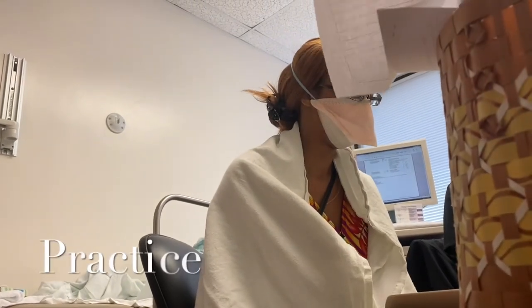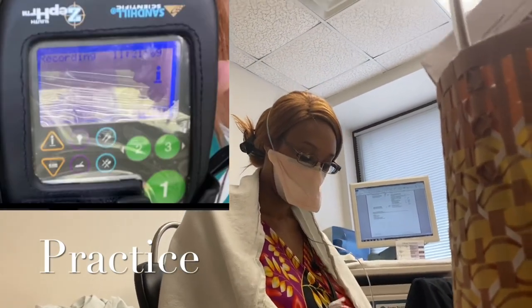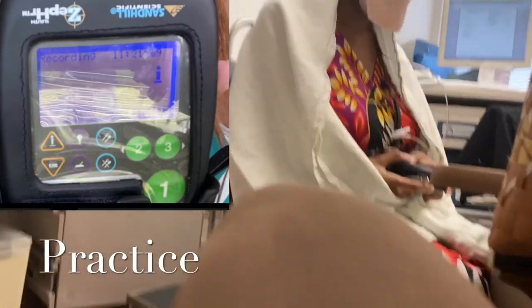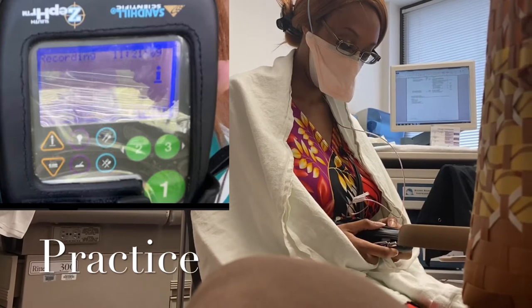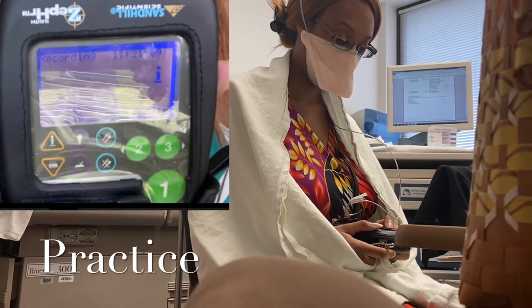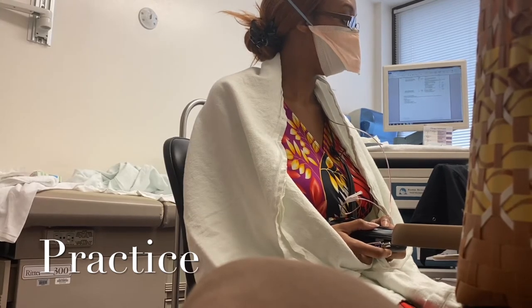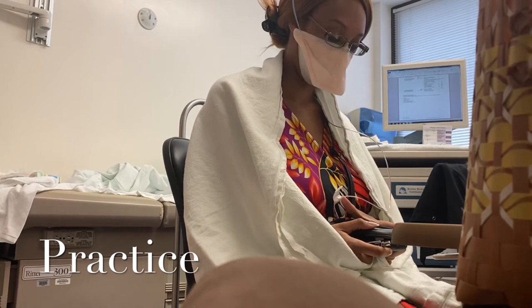Let's bring your monitor around so you can see it. It goes dark to save the charge from the battery. Push the light bulb. And see how it says recording? It should always, always, always say recording. If you look and it doesn't say recording, call, because something has happened and it got bumped and got out of the recording mode. We can troubleshoot over the phone and get it recording again, okay?